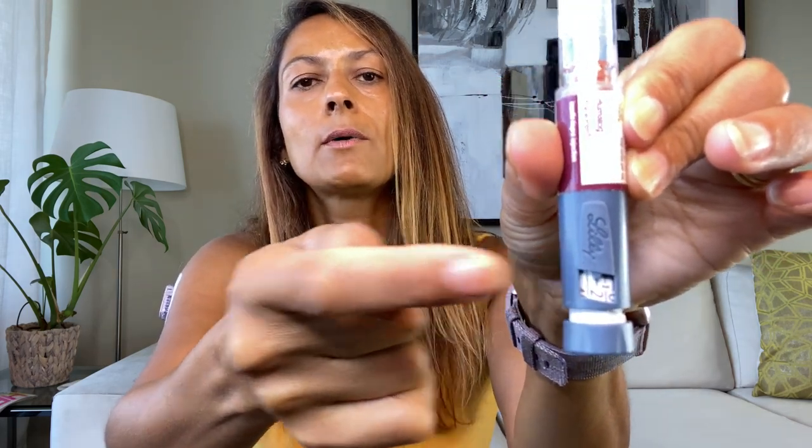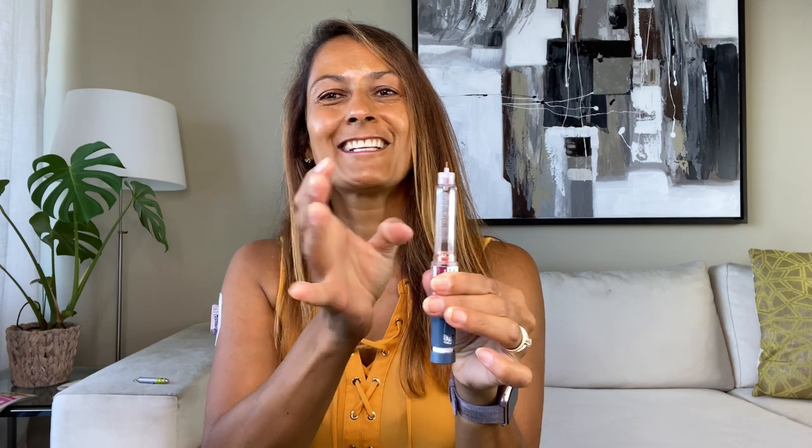Next step is to do an air shot. We do that to make sure insulin is flowing and that you're not injecting air. Dial it up to two — you can hear the clicks and see it in the little window. Do a few clicks to get any air bubbles up to the top so you can get those out of the pen.